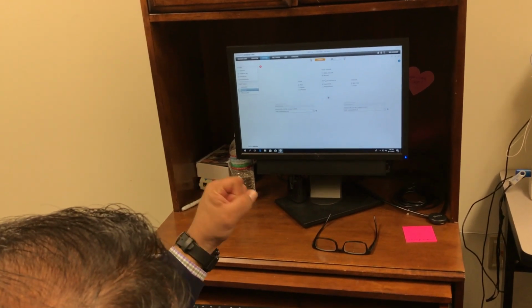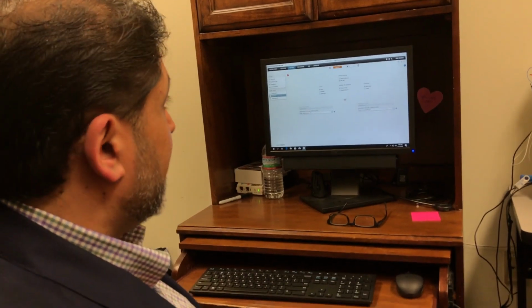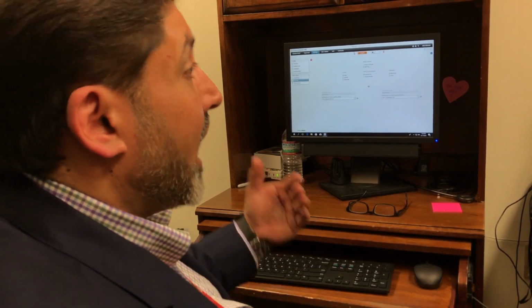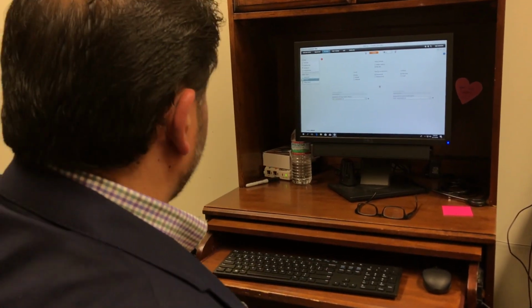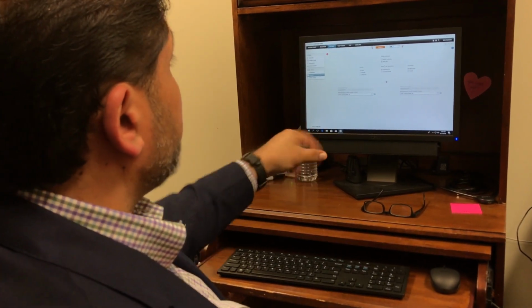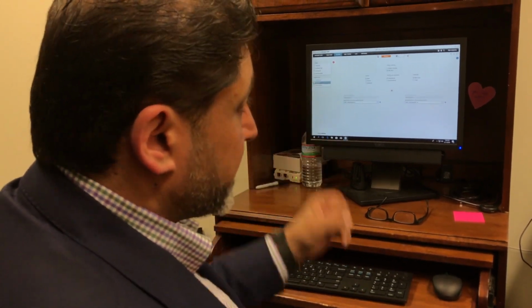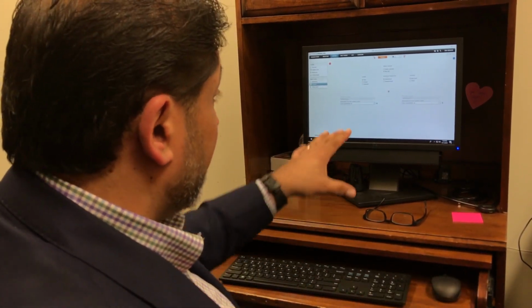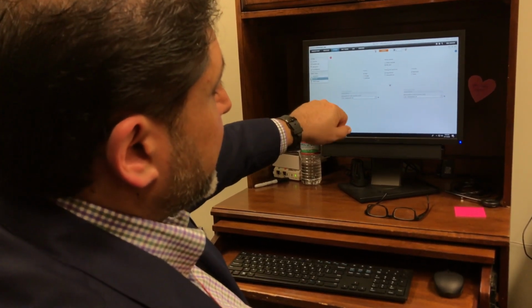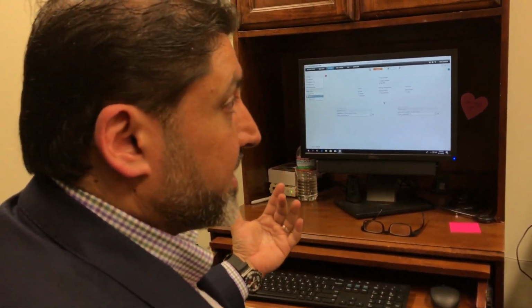Okay? And you have to make sure you put the notes in your chart, because someone's going to come back and say, well, that's a mistake. This person speaks English. Well, I did that because I wanted to give them slow acting compression. Okay? So these are all the things, most people just go in and hit quick fit and they're done. You can't do that. You actually have to sit and spend some time on this. I'm struggling a little bit because I don't use this very often. But you'll get in here, you can set this up and very quickly change this, and then once you know the theory, it's pretty simple.